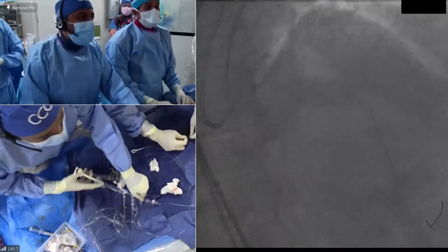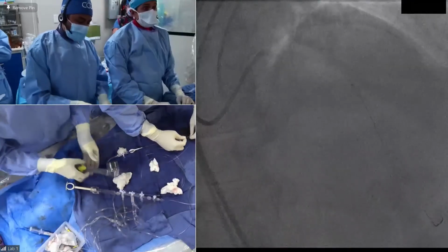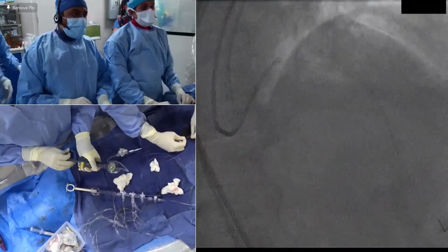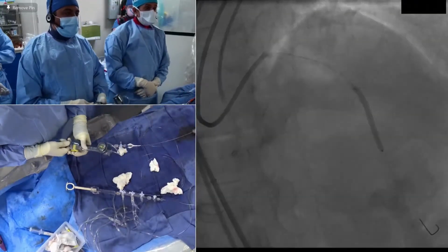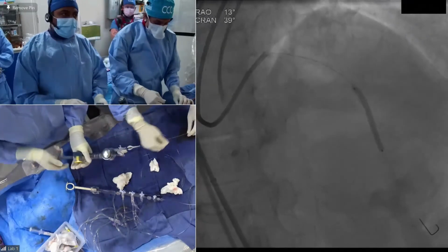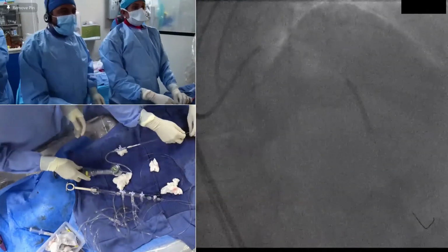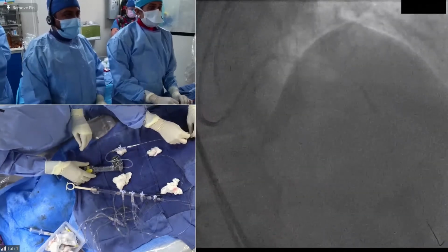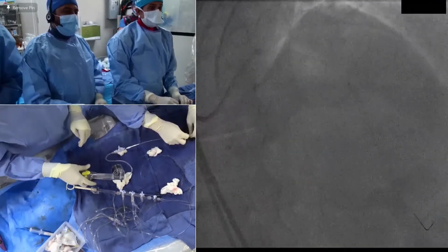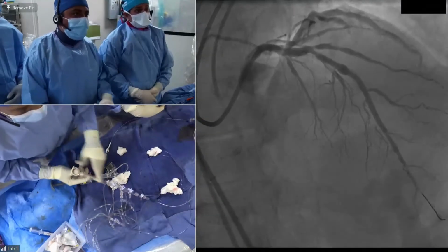It's a good point to remove the buddy wire before you deploy the stent. Don't forget that. George, in terms of the standalone cath lab, I do think that the shockwave is going to have a big role instead of possibly Rota in these places. Yeah, probably true. I think one of the things we were fortunate to have at BI is we had surgery and a trained cath lab, so it's really about your techs and your nursing staff. So anything that is the easiest on the staff. Want to dilate the proximal part of the LAD, right?